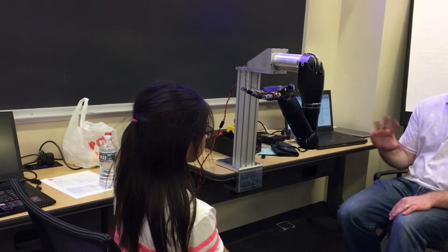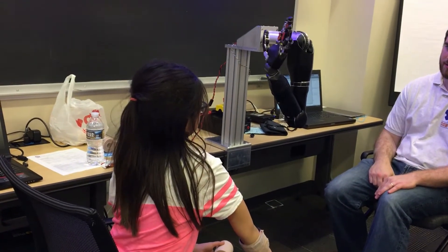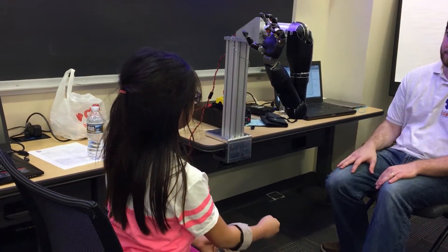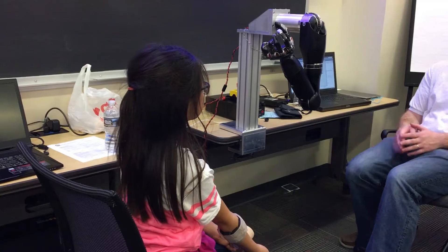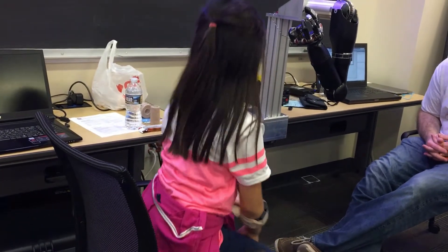So now you should be able to control rotation and grabbing. There you go. There you go. You got it. Excellent. And then try squeezing your hand. Rotate out. The other way. There it is. Pretty awesome. Well done. Well done. Cool. Thanks for stopping by.